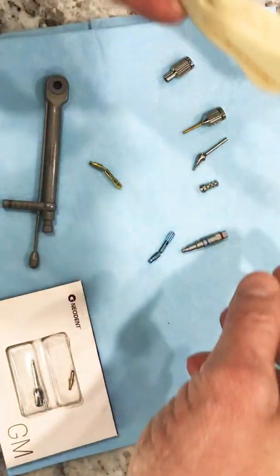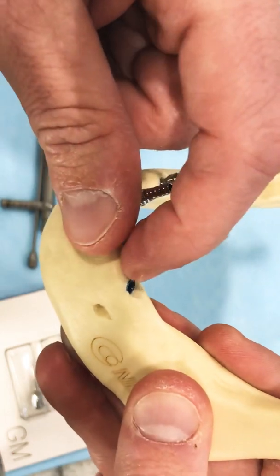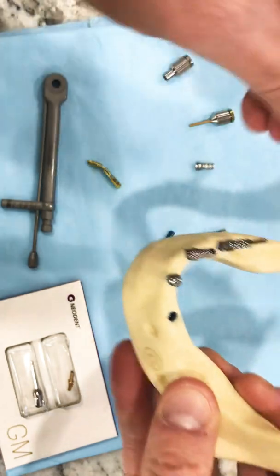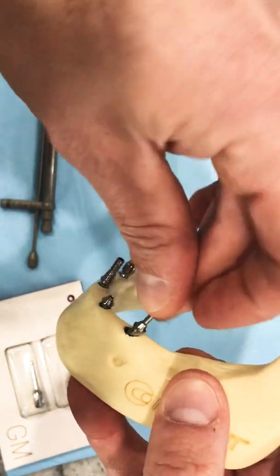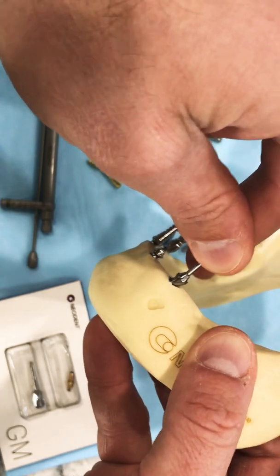So the last thing is our bone profiler. I want to know that if we sink that implant — I can see on the distal aspect here that it's down in the bone. And if need be, when we go to place our 30 degree angled abutment, maybe it's hung up on bone a little bit and it doesn't seat all the way.